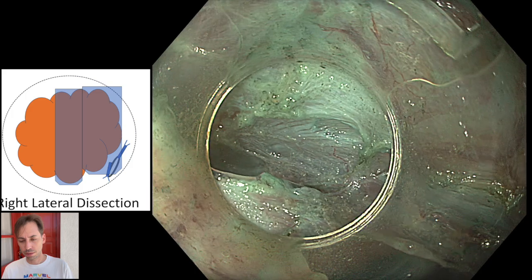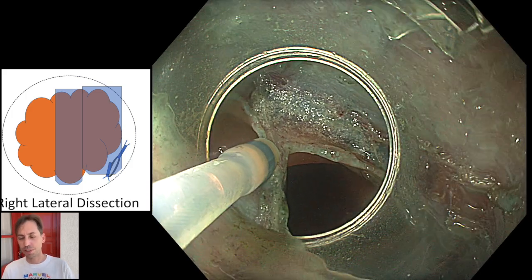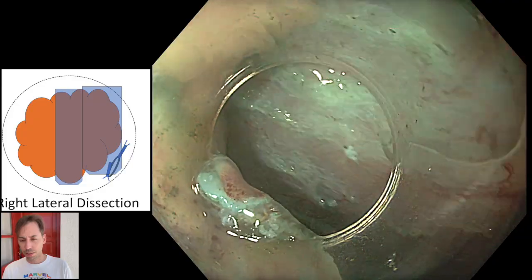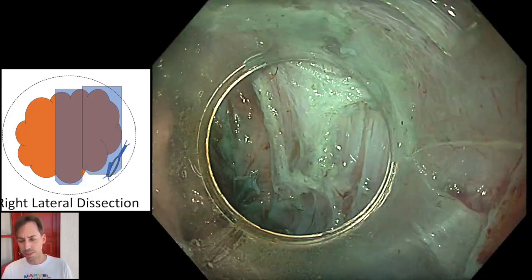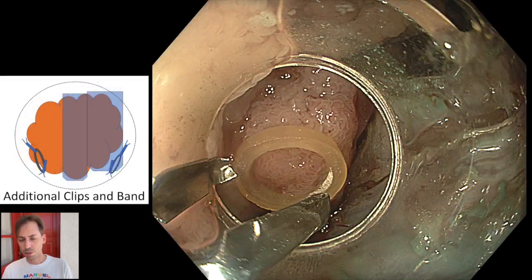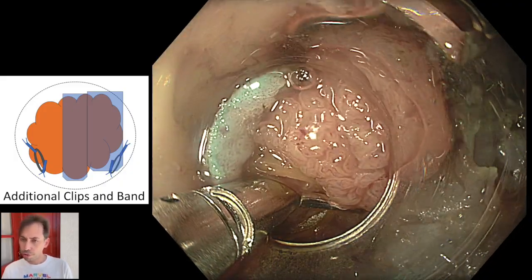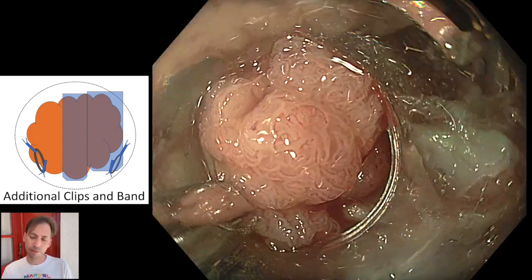And although it looks like we have done a significant part of the procedure, we still have work to do. We have to work now the left side, and for this part we will turn the position of the patient to the other side, and I will use a new complex of clip and band to have additional traction. Although we can continue like this, you gain some time by having additional traction.